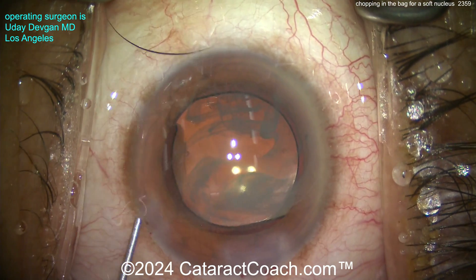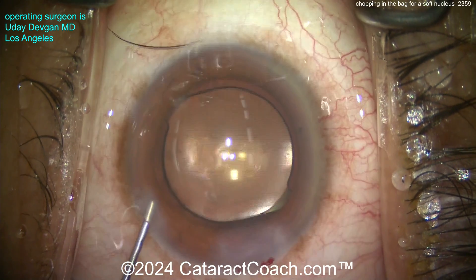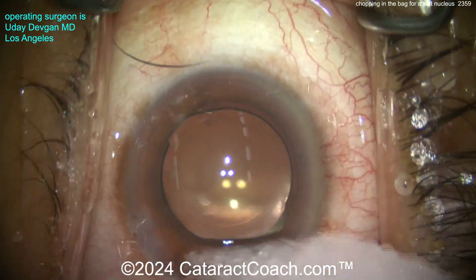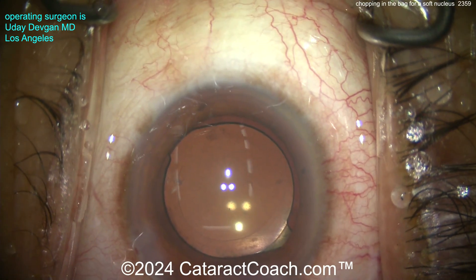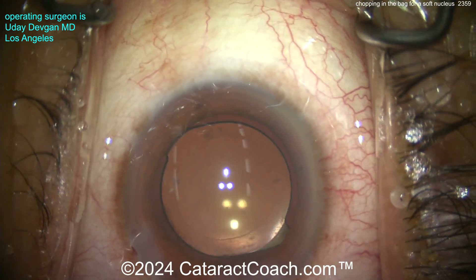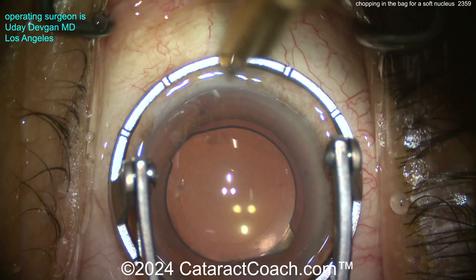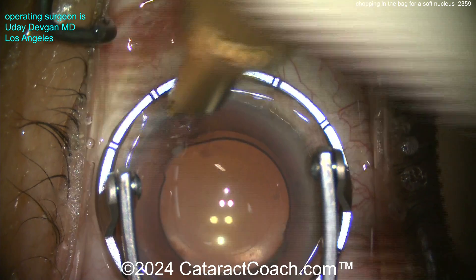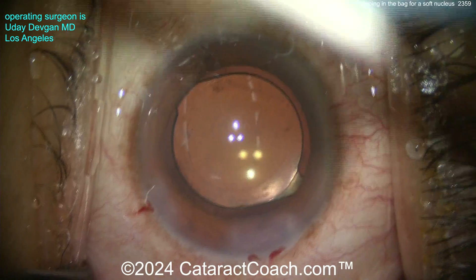Some triamcinolone going inside the eye — just a little bit, about 0.5 milligrams, preservative-free. Putting some preservative-free moxifloxacin inside the eye as well for endophthalmitis prophylaxis. There's the Weck-cel sponge — got that one lash out of the way. We're going to do an LRI for a little bit of astigmatism — about a half diopter of against-the-rule astigmatism after the main incision. Let's see — there's the LRI, about a half diopter's worth.